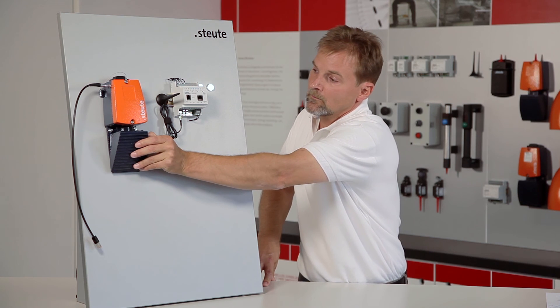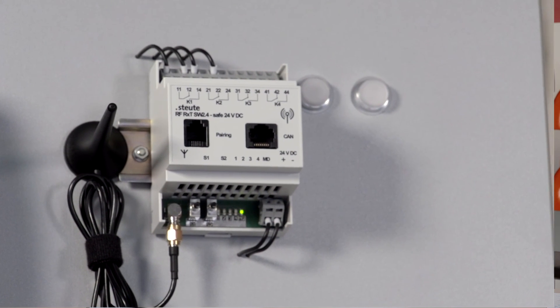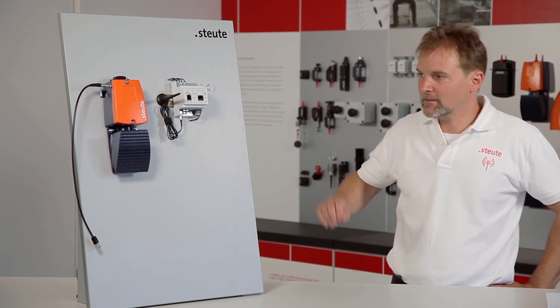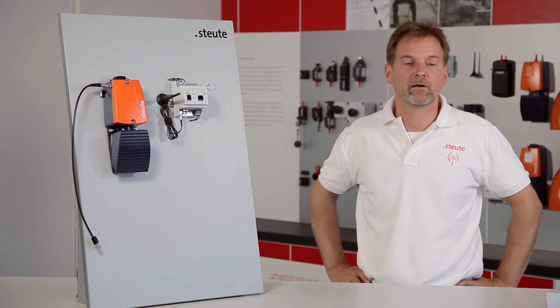If I now press the pedal, the wireless signals are reliably transmitted to the receiver. This was a successful demonstration of pairing between a wireless foot control and a wireless receiver plus their subsequent operation.